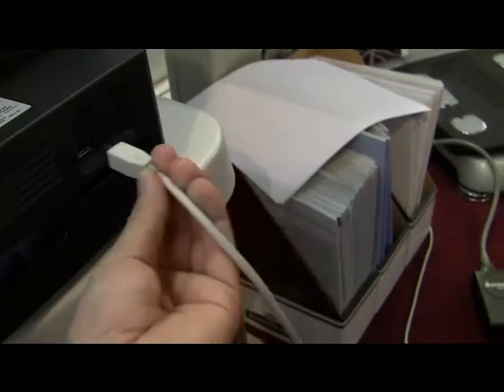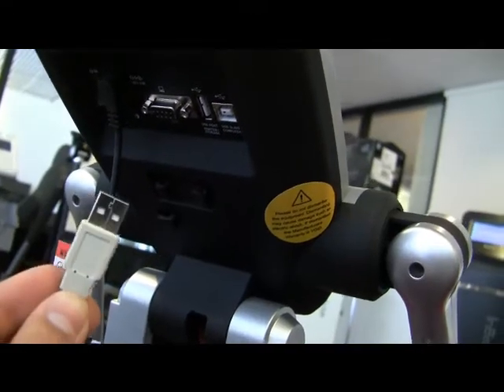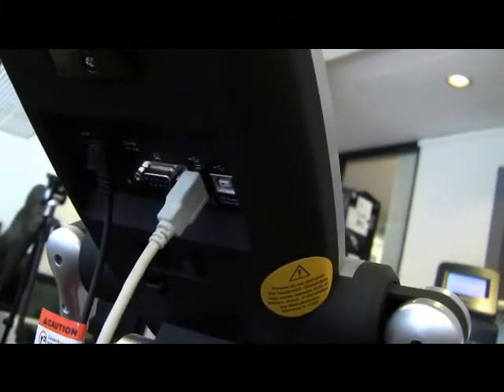If using a printer, load the result sheets into the printer and plug in the USB cord as shown. Make sure the USB cord is plugged in firmly. Turn on the power.